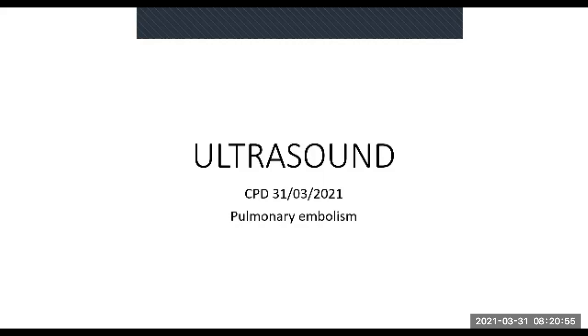It sounds a bit scary. How am I going to find an embolism with ultrasound in the lung? So we're going to logic it out a little bit and figure out what we would expect to see, and then look at those things and see what we actually see. Because in essence, an embolism is nothing more than a plumbing problem. Seriously, that's it. It's just a problem of plumbing and what happens because the plumbing is not 100% okay. Okay, so let's start.